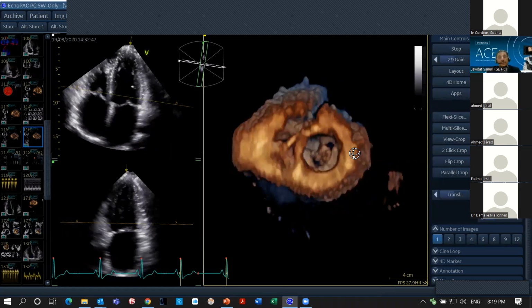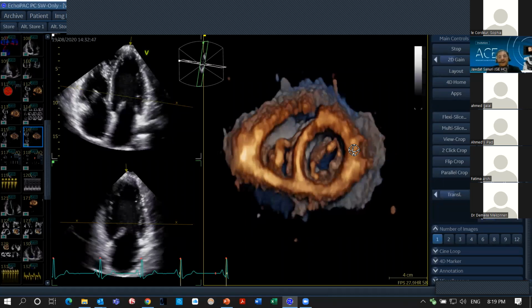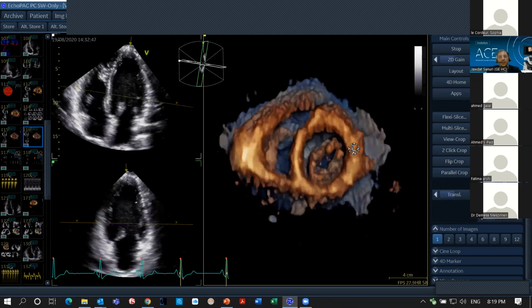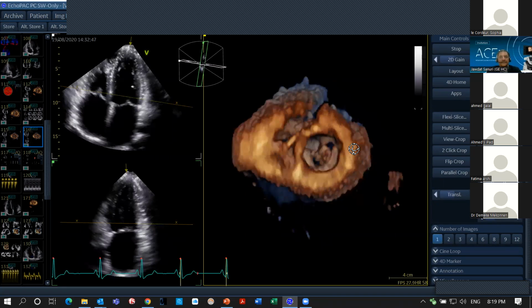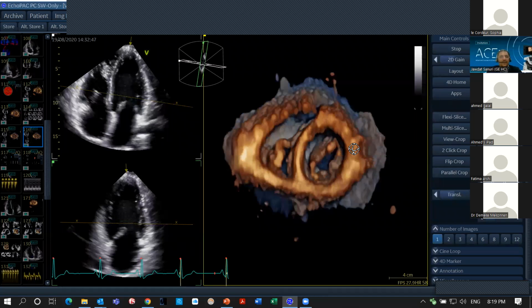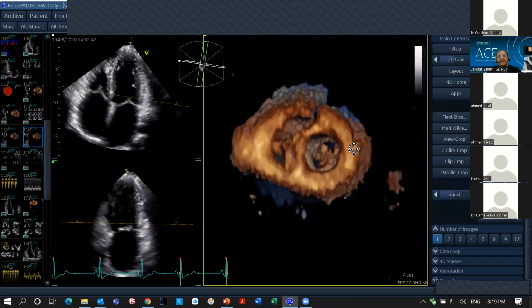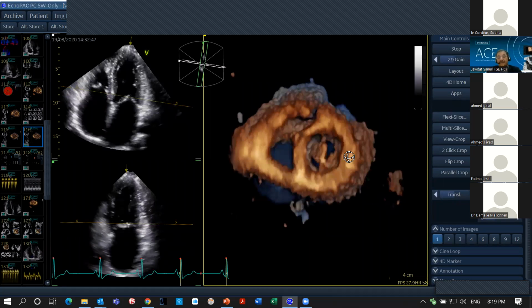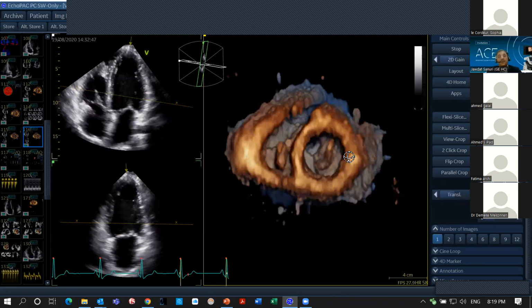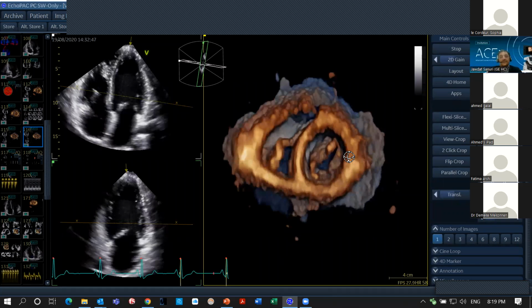Of course, DICOM is the standard of medical imaging where all the measurements are done. There's also always growth in that field. There's HIMSS, which is Healthcare Information and Management Systems Society, I think, Congress, which is held every year. They have what they call connectathons, where they try to connect between different vendor machines and different vendor PACS solutions.